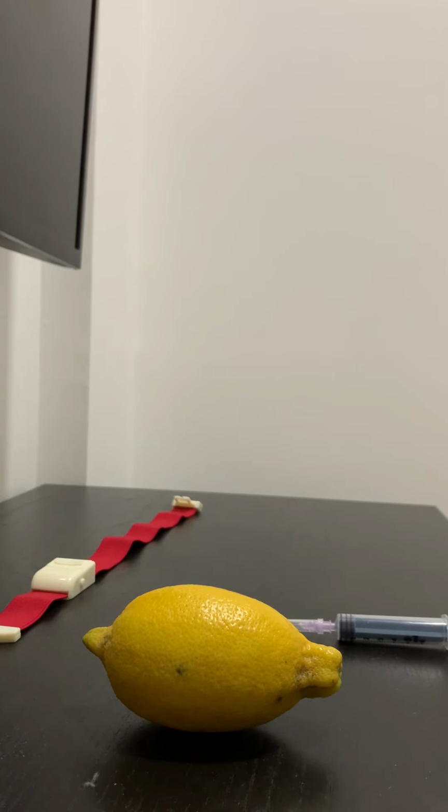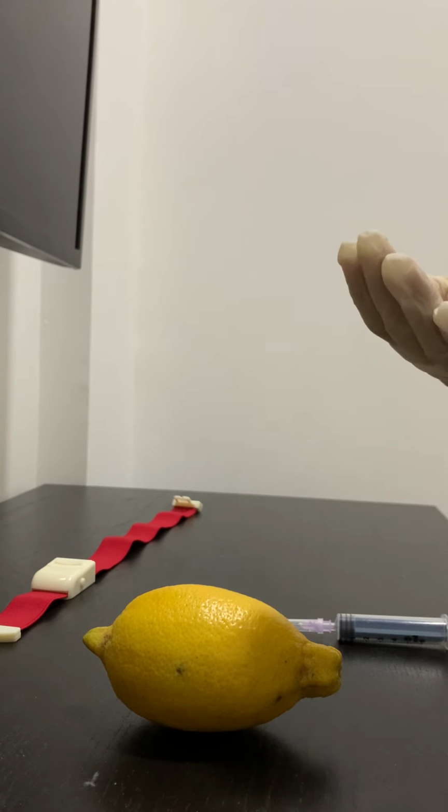Hello everyone. Today we will be talking about giving injections. Injections are a way of administering a sterile liquid form of medication into the tissues of the body beneath the skin, usually using a sharp, hollow needle or tube. This is a parenteral way of giving injections.